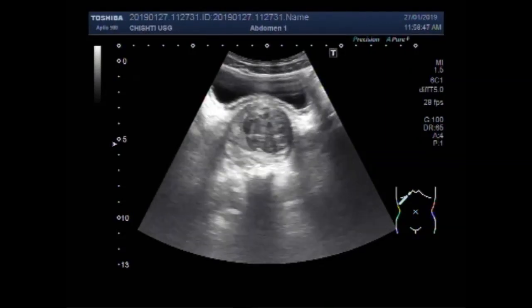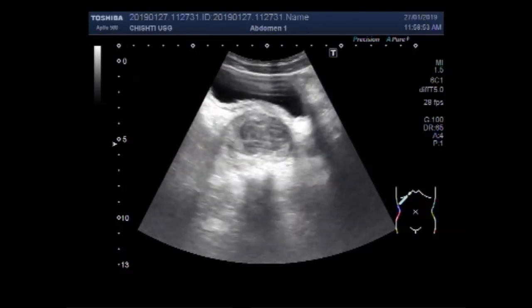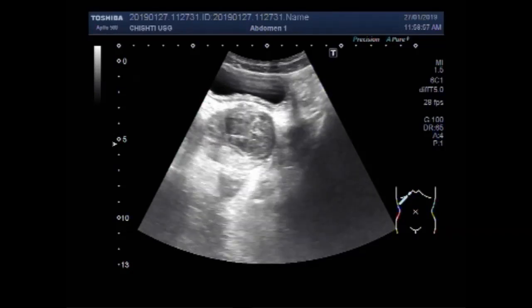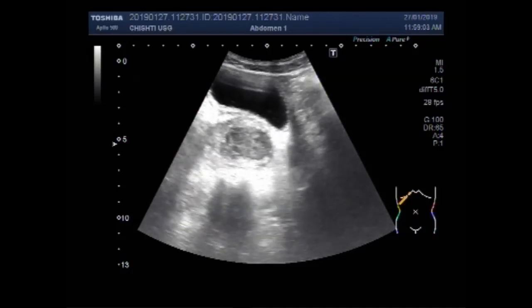Dear viewers, I hope you are all fine. This ultrasound video shows enlarged prostate with the mass in its interior, in the upper and lateral portion of the prostate.